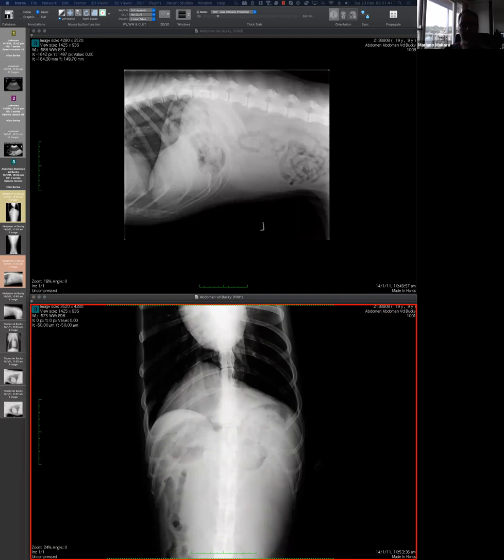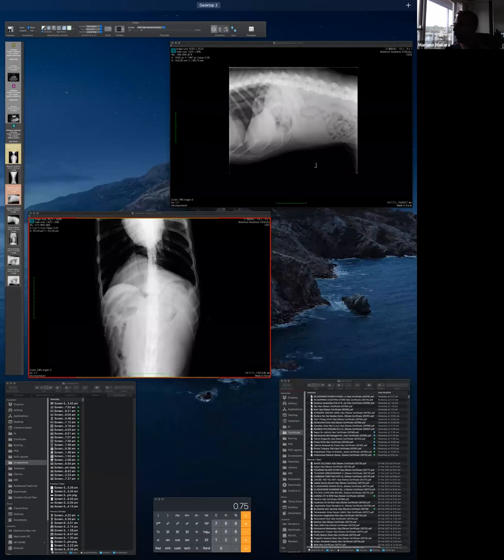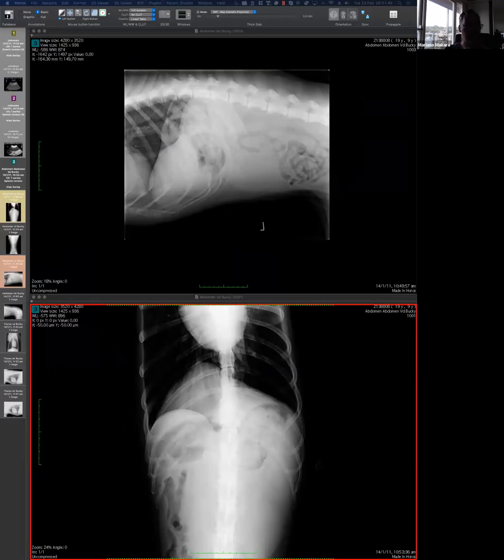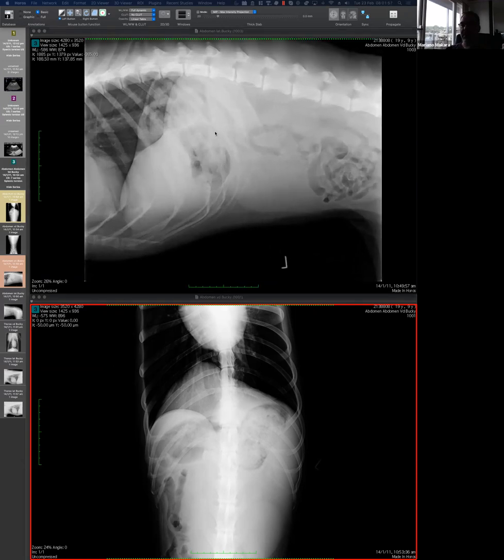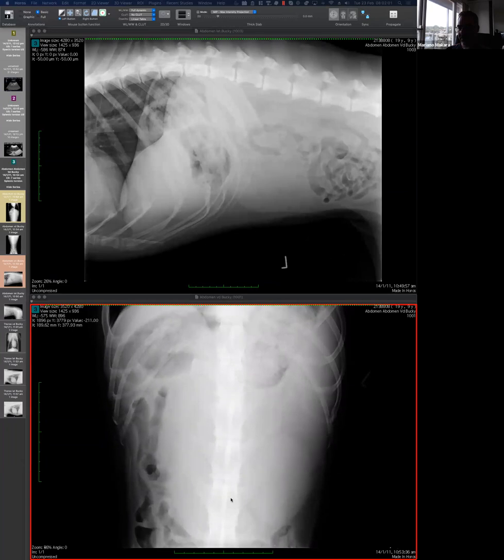Would you like me to share the link to the images? Okay, here you are. Sorry, I'm technically slow this morning. Me too. Okay, so the images are there. You can start taking a look at them.